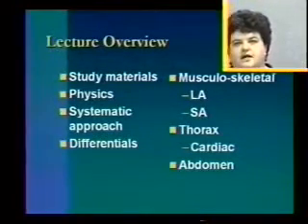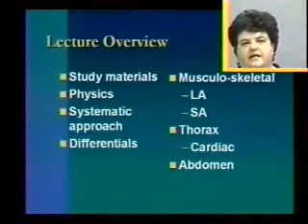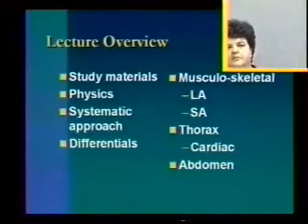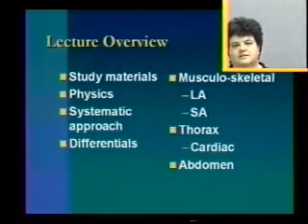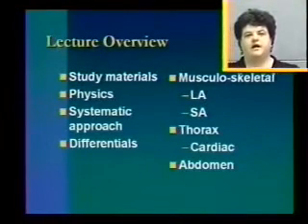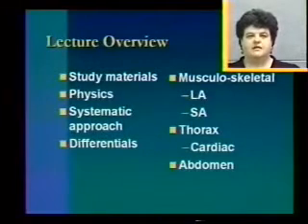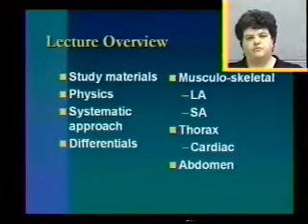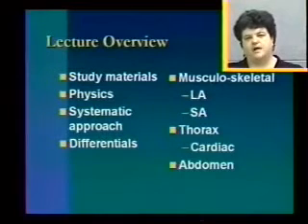Obviously, it's not something that I can go over in depth, but just the things you may need to know for the board exam. I'm going to talk about the systematic approach to reading radiographs that you all need to employ in order to pass the NAVLE exam and also in everyday practice. And then I'm going to talk about differentials for a variety of appearances of radiographic abnormalities.